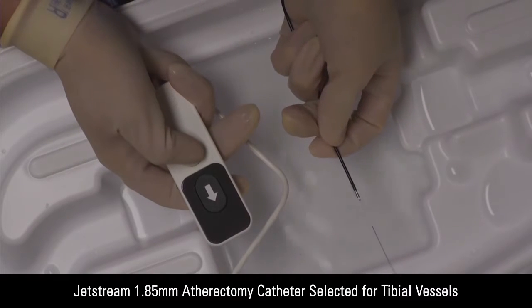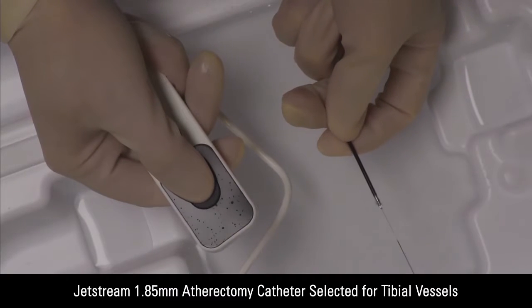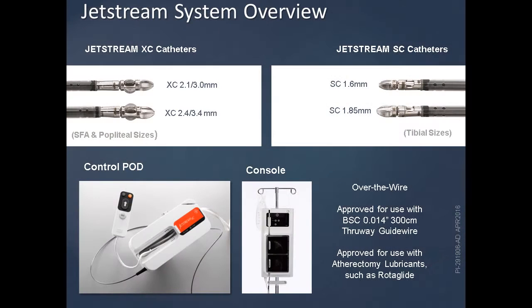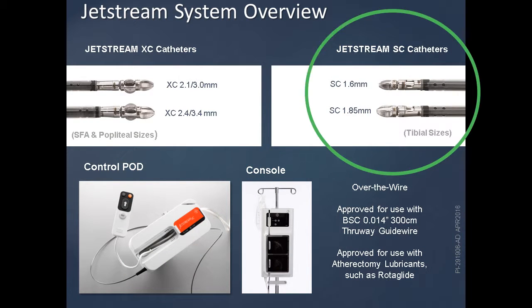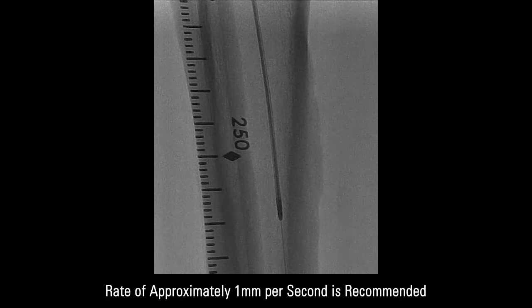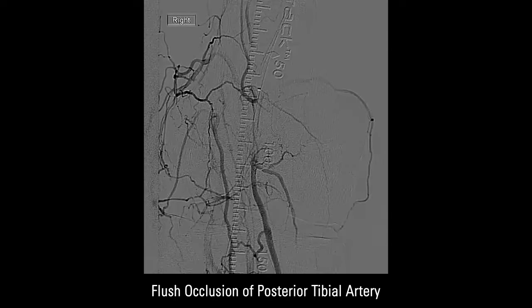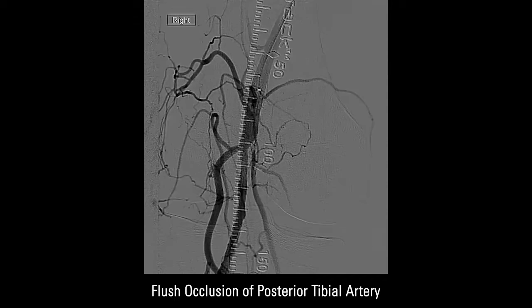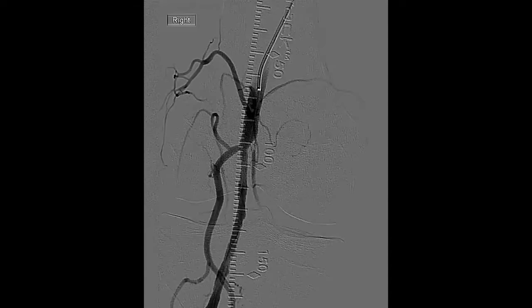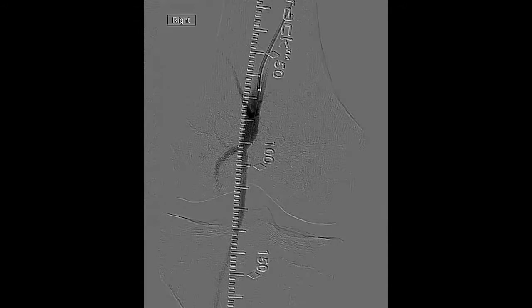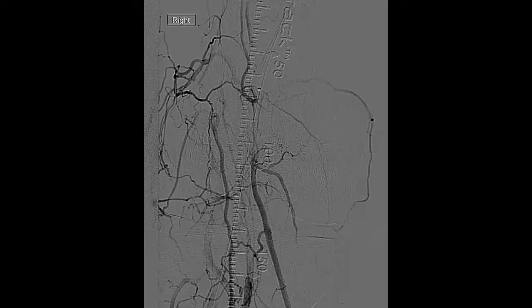The next step is to proceed with aspirational atherectomy from the peroneal artery. At this point we are using the smaller 1.85 mm device. The major difference between the above-the-knee and below-the-knee devices is there is no blades-up modality, and it's only one size for aspiration. We're performing aspirational atherectomy from the mid-peroneal artery. You can see the flush occlusion of the posterior tibial artery. That branch visible in the beginning is one of the genicular branches, not the posterior tibial artery. We have established flow to the peroneal artery, but we need to establish flow to the posterior tibial artery without compromising the work done here.